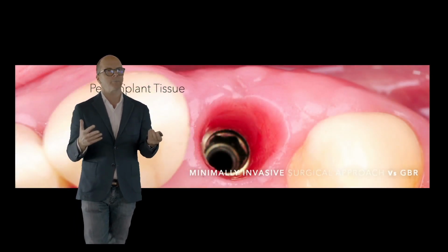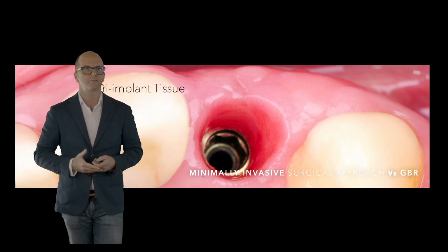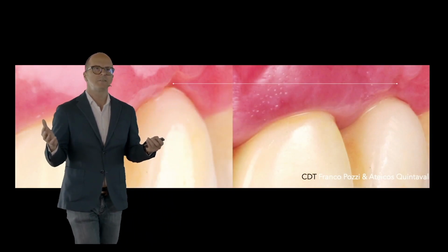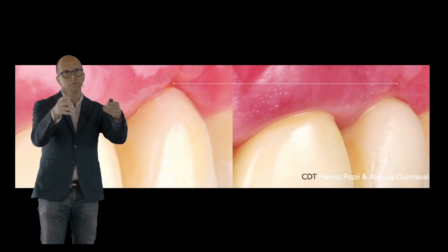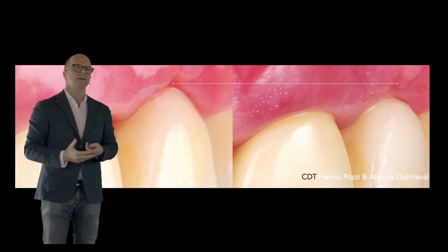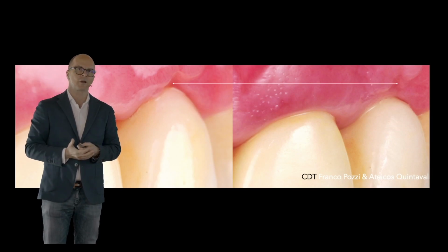This is what I like about the Prama. I want to win easy. I want an easy win. This is what we got. We just have to wait for the soft tissue to adapt, to seal the neck of the implant, and to adapt on the landing zone of our emergence profile of the crown.